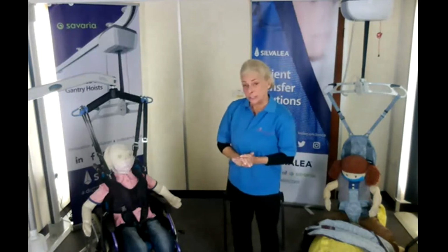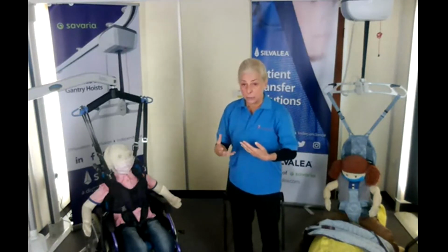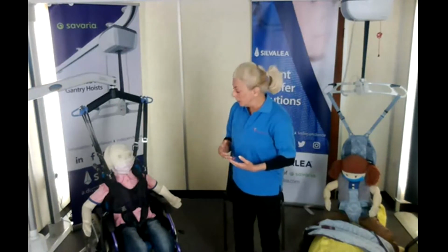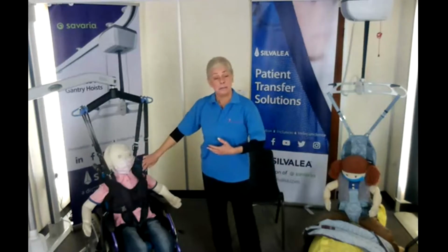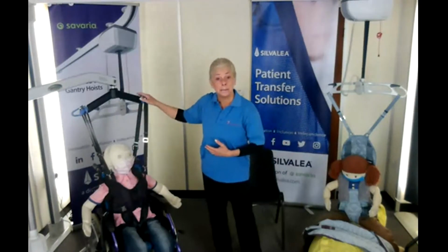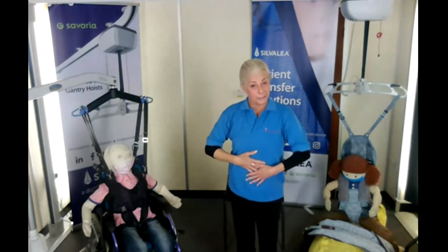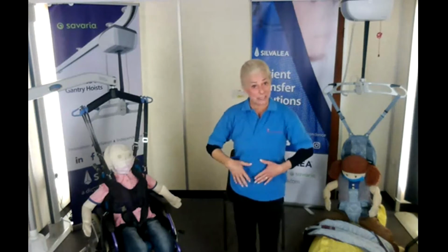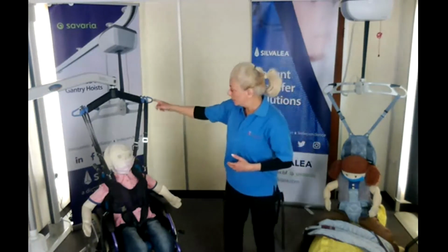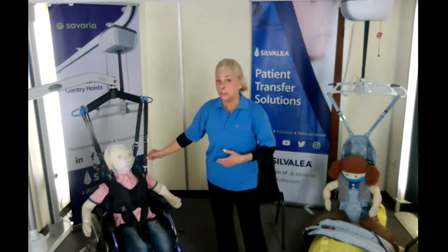And it's widely used in schools. It helps to take away the handling. It also is used in this type of situation if the tapes are attached to the hoist, then it will help someone to sit up, so all their energy is not taken up with trying to sit up because the hoist is supporting them with this little jacket. So really quite a useful respect.